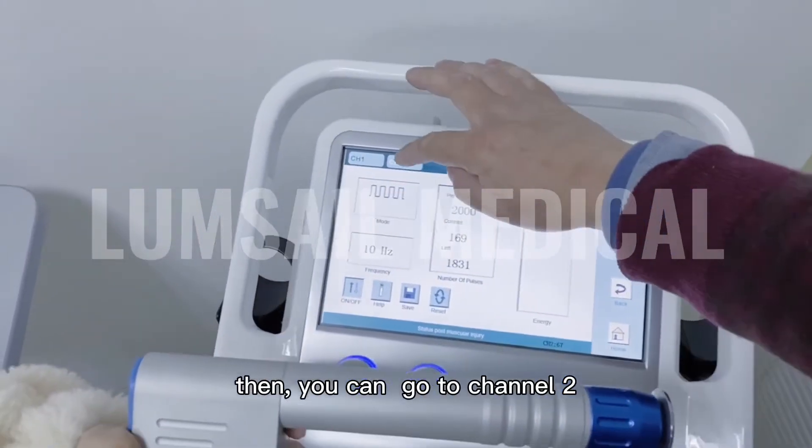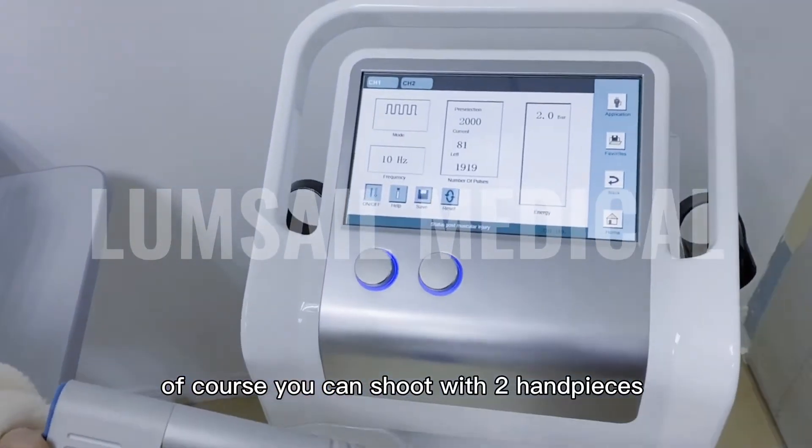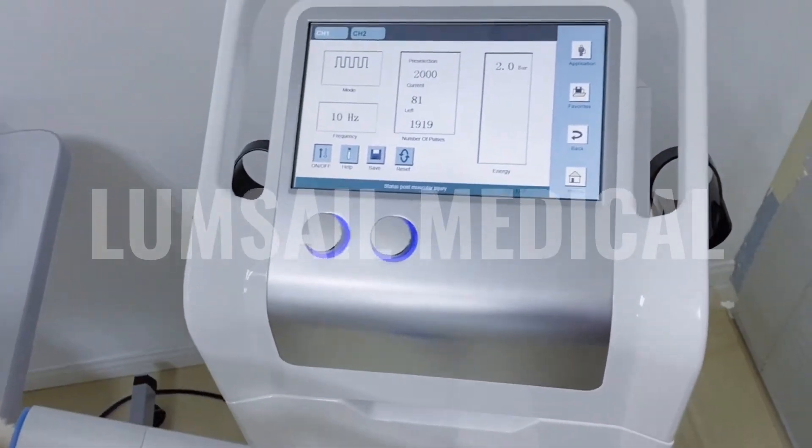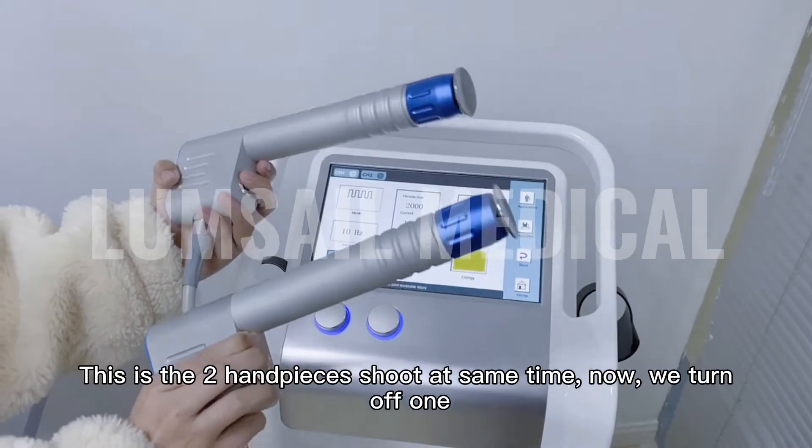You can go to channel 2 and shoot at the other handpiece. You can also shoot with the two handpieces together at the same time. Let's see the two handpieces operate simultaneously.